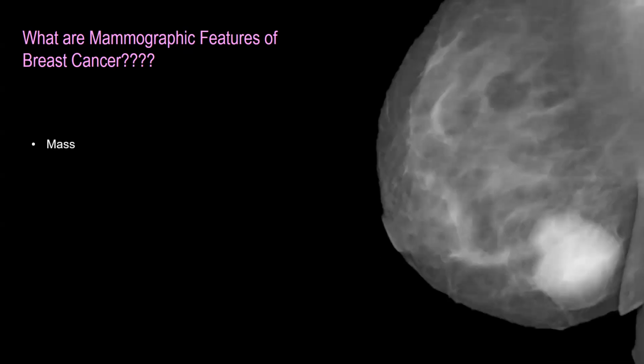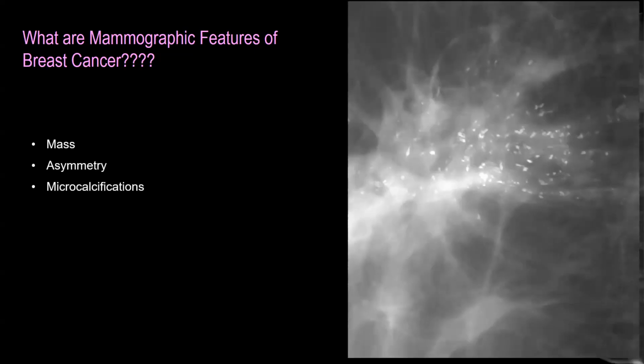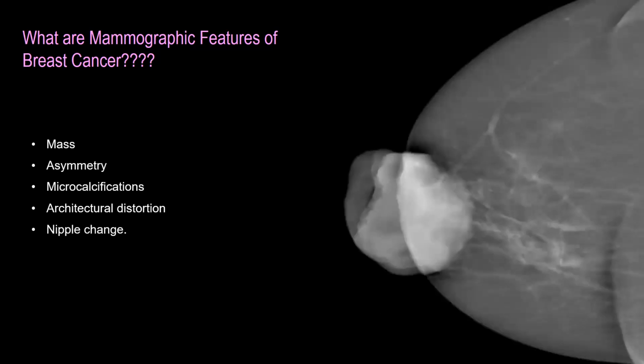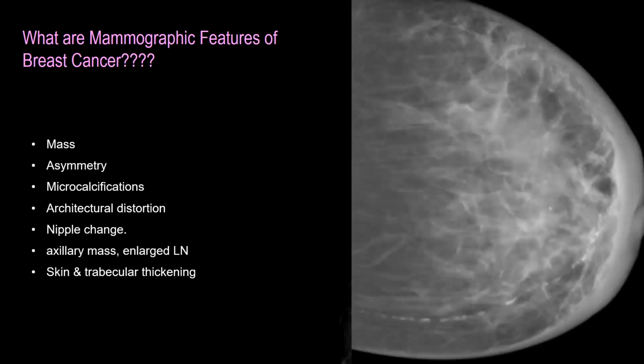What else? Nipple changes. Skin changes, edema, and axillary lymph nodes. Okay.